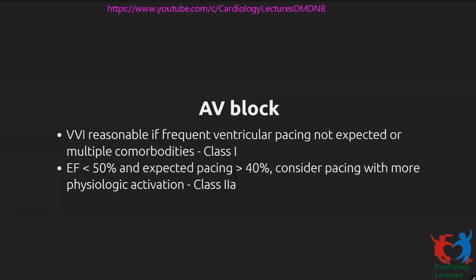Even in a patient with persistent AV block, if they cannot afford a dual chamber pacemaker, or there are other reasons where you want to avoid putting a dual chamber pacemaker, VVI pacing is very much reasonable. But if you can, I think DDD is fine. Now again, between dual chamber and VDD, VDD is an option which is used less and less now, but definitely it's an option to consider.